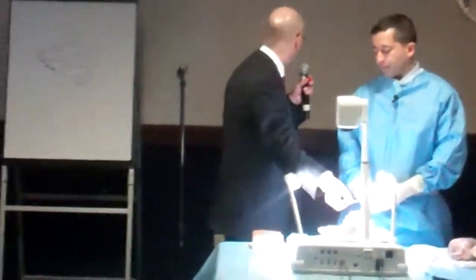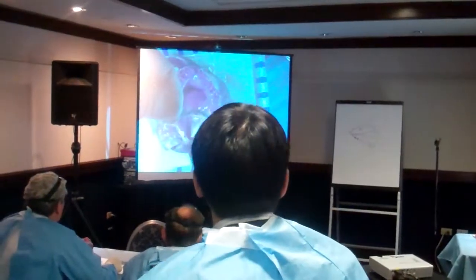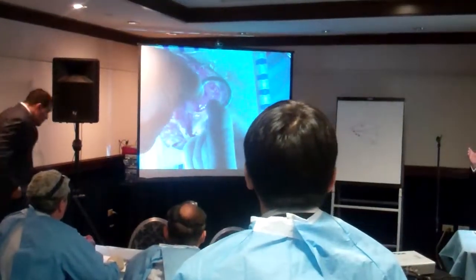Now look at how open this ring is. Look how much more open this ring is — you see the space? It's not five millimeters, it's two centimeters.